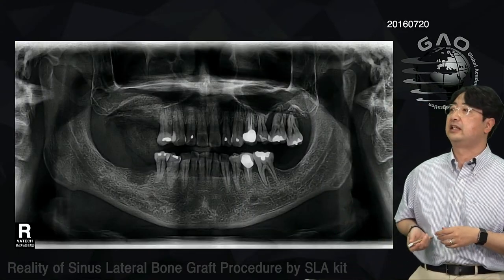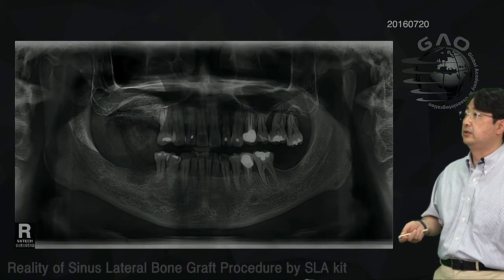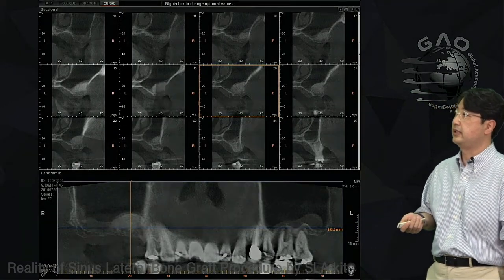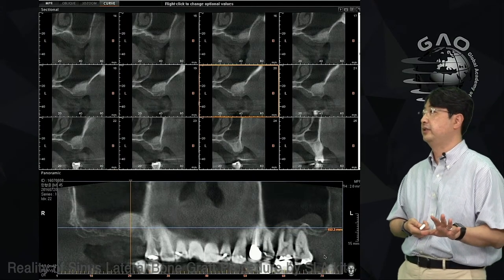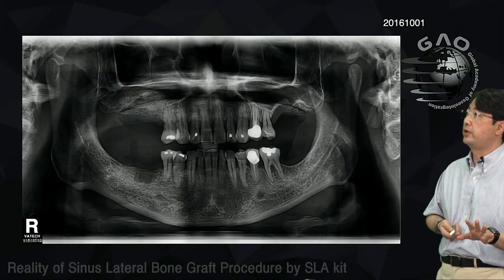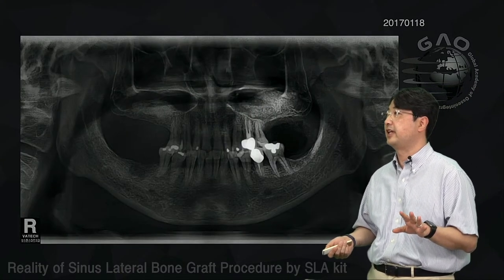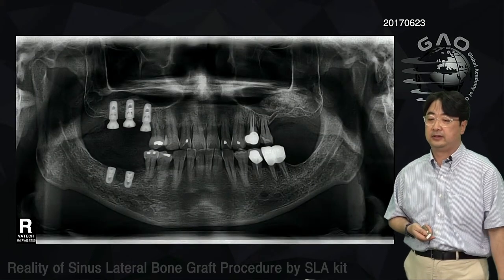Okay, so this is revisiting the maxillary sinus graft case, right? Here you can see the bone graft on the right side. And here is the CT scan after the sinus graft, after the second sinus graft, right? Then this is how it looked afterwards, and we waited. And I did the lateral approach for this left side as well. Okay, then we placed the implant like this.